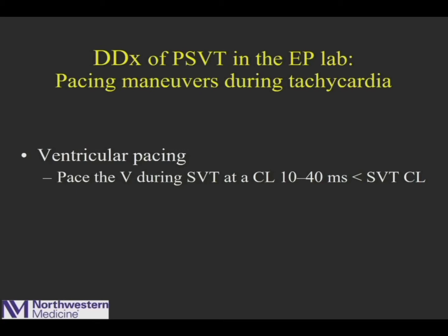And it sounds simple, but you need to make sure that when you start pacing from the ventricle, that you're synced properly, and that the first pacing stimulus comes in at a long coupling interval so that you can gradually capture the tachycardia. You can't just blindly turn it on, or you may come in randomly and terminate the tachycardia with the first beat. So it's more than just understanding what rate and the response. You have to make sure you've entrained it and that you properly time the onset of pacing.